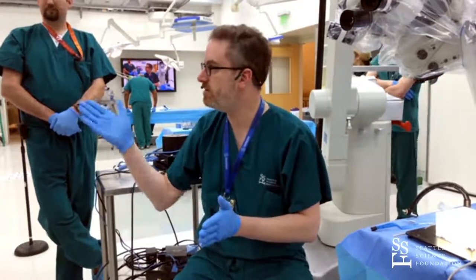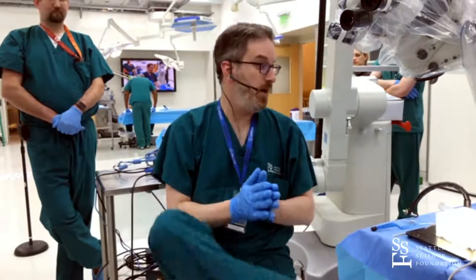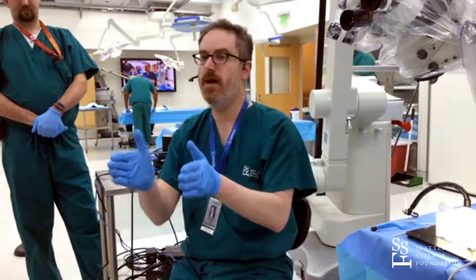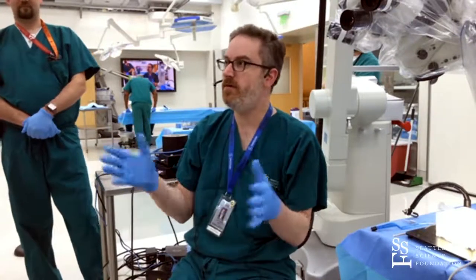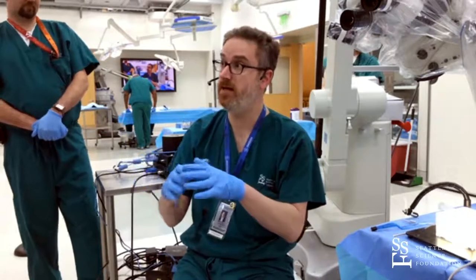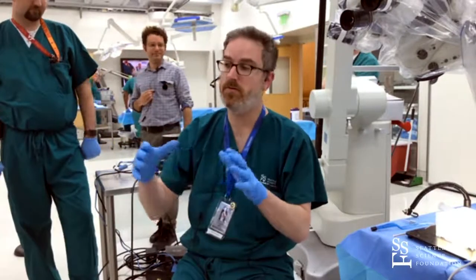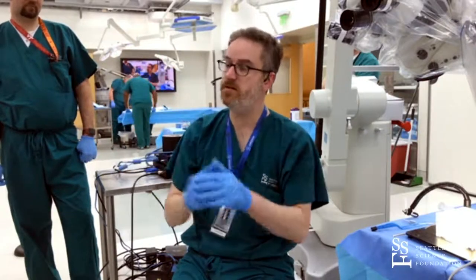If you don't have DTI available, one of the nice things is that with all the publications coming out regarding this approach, there are certain standard corridors. Even without DTI you can do dead reckoning based on regular surface neuroanatomy and get an idea of a relatively safe trajectory. There's an anterior corridor, central corridor, and a posterior corridor that really revolve around the SLF, which seems to define a lot of these structures, with pyramidal tracts separating your central from your posterior corridor.